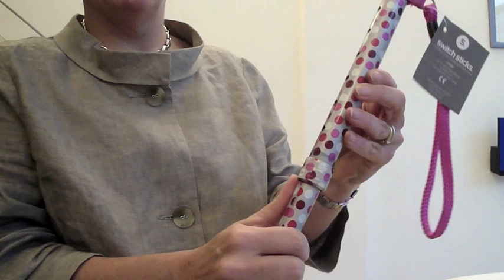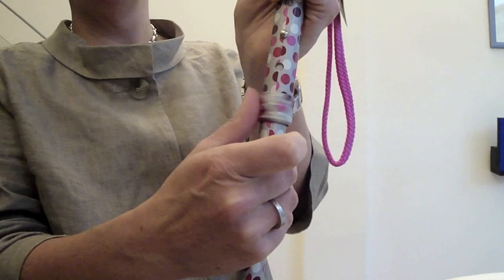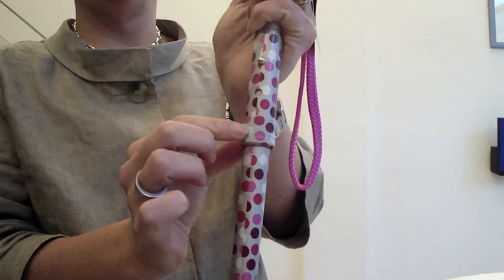Then you find the little hole and pop the pin in. Absolutely critical: you must tighten this band. When tightened securely, if you catch the little pin, the stick can't go up or down. It's a safety feature and it's very important that it is re-tightened.